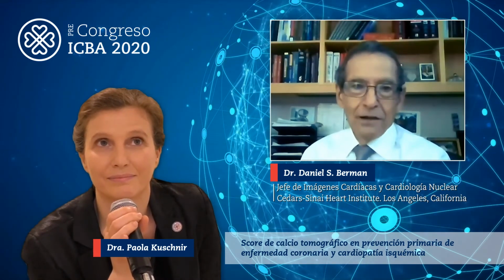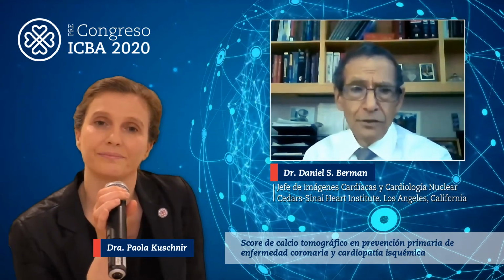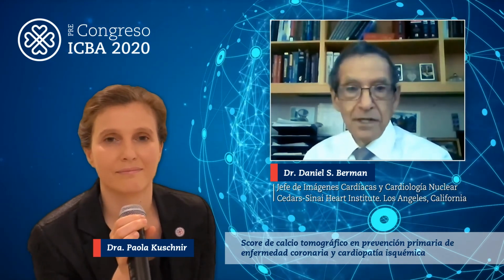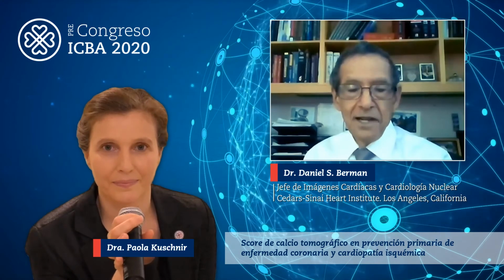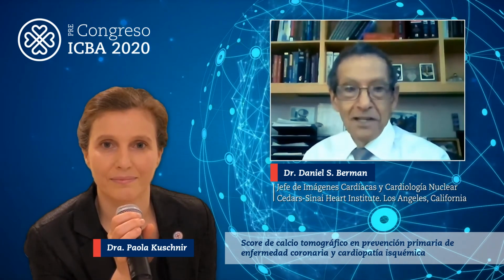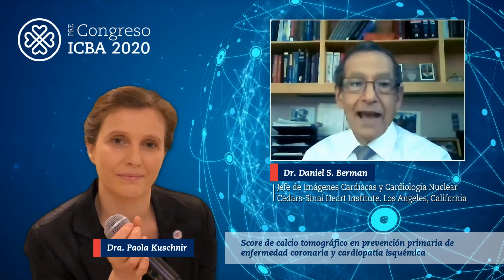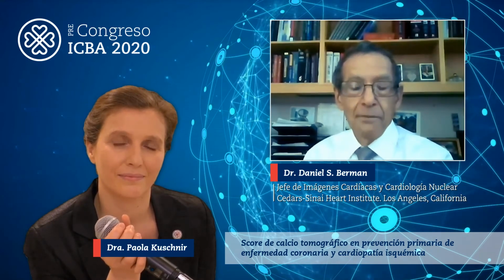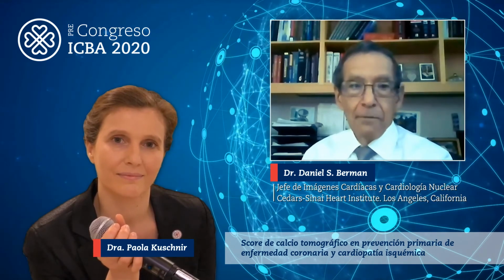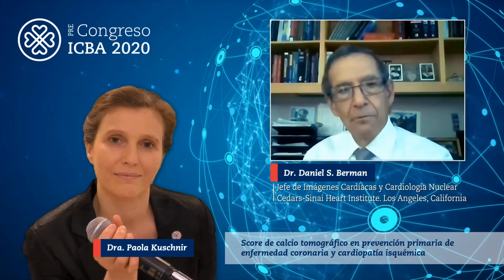Years ago, we did a trial called the Eisner trial of 2,000 patients, two-thirds of whom had scanning, and one-third just had risk factor assessment and recommendations to the patients. What we found is that the patients in the scan group, over a 4-year period of time, their Framingham risk score, which is what we used at that time, stayed the same, whereas all the other patients had the expected increase in their Framingham risk score.